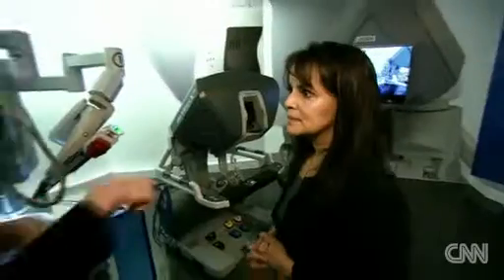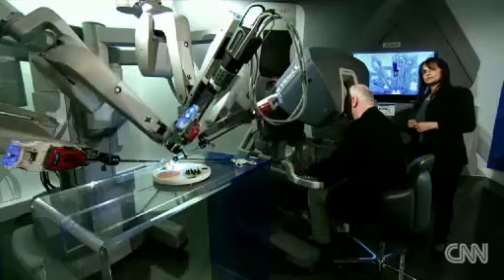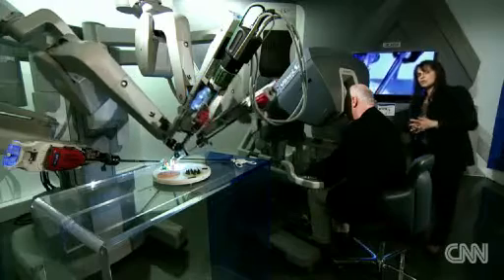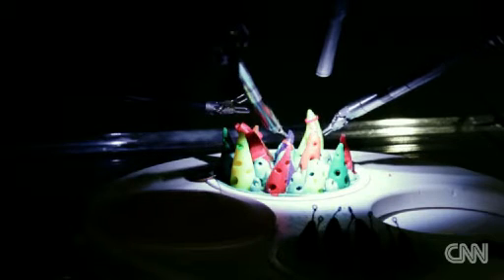Okay, moment of truth. Can I sit in the chair? Yes, please. Sit down. So, under her watchful eye, I gave it a go. And now what I'm going to have you do is, you see the red ring there on the blue cone? I see it. Pick that up with either your left or right hand, your left or right instrument. Let's try it with my left hand, snapping away. And you can turn your instrument a little bit if you need to.